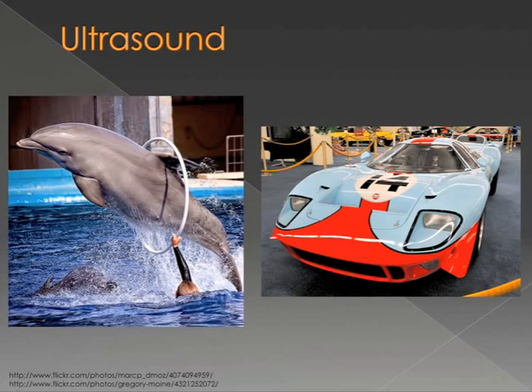Another thing to think about is the sound of a race car flying by on the track, or a car, and how the pitch of the horn changes as it drives by. This is the Doppler effect that allows us to measure blood flow.